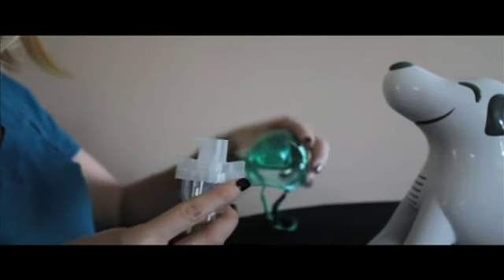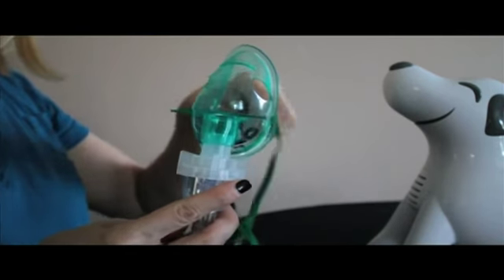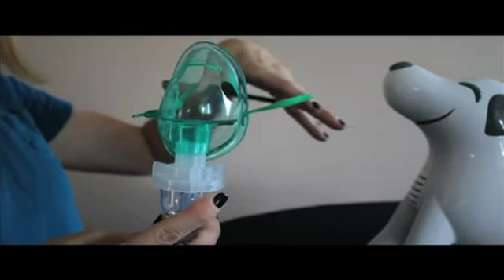To use the child mask, attach it to the top of the nebulizer and secure around child's nose and mouth.